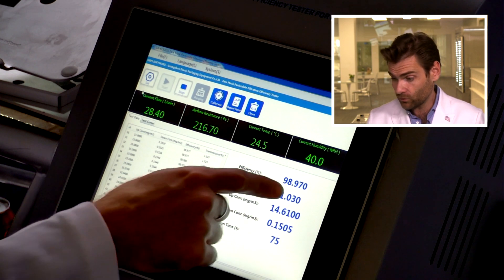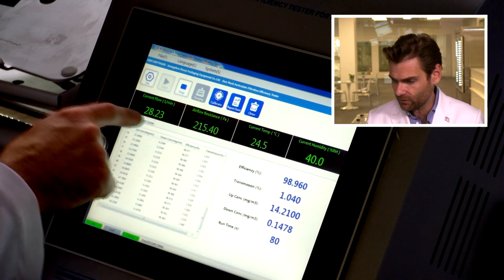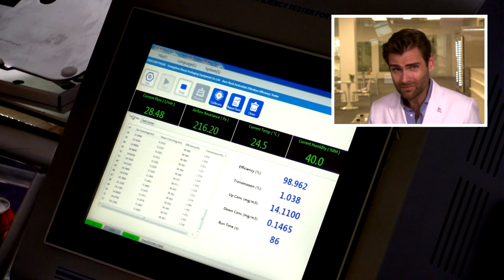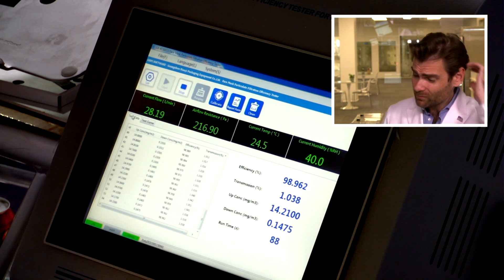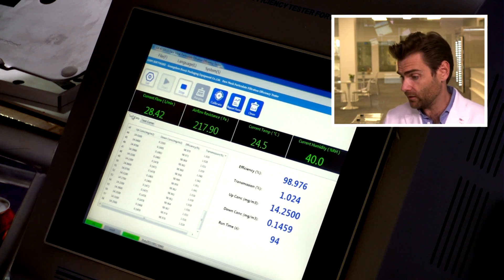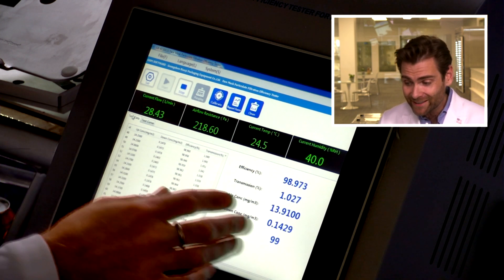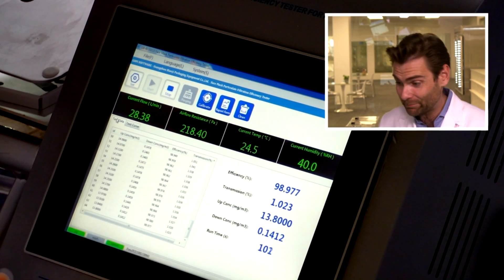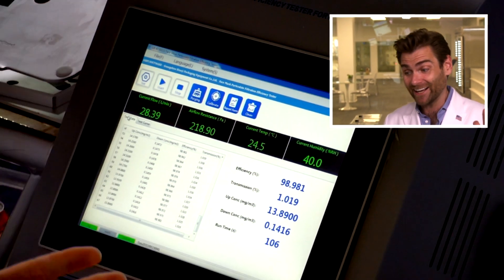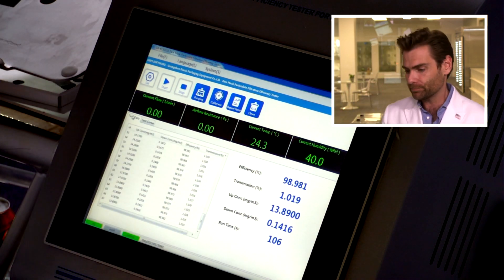I love a KF94 — look at that, at 98%! The test curve stayed right above 95 the whole time. Airflow resistance is 215, which is a little high and will make it harder to breathe, but the KF94 style gives you a lot more breathable area. I think this is going to test really well — may even make it to 99%. Just missed it — didn't happen.